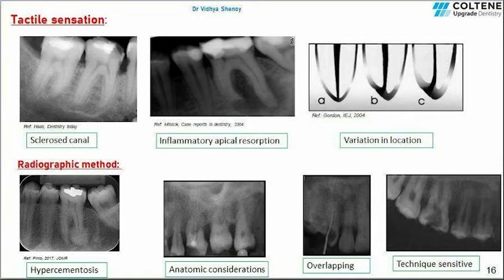One of the drawbacks of the radiographic method is when the apical foramen exits from the side of the root or in a buccal or lingual direction, it becomes difficult to view on the radiograph. Second thing is, if there is dense bone around the tooth or anatomical structures which can make the visualization of root canal files impossible, working length determination is difficult again.